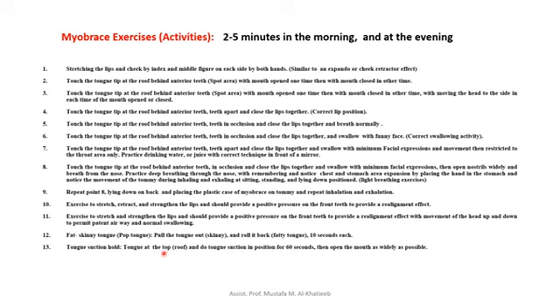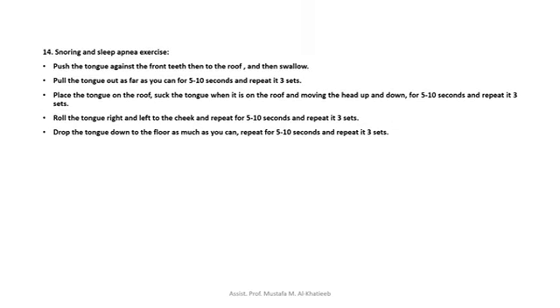Fat skinny tongue: pop the tongue out skinny and roll it back, then fat tongue, 10 seconds each. Tongue suction: hold the tongue at the roof and do tongue suction, and then open the mouth as well.